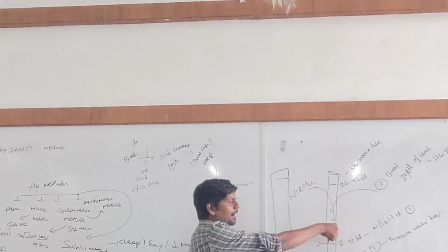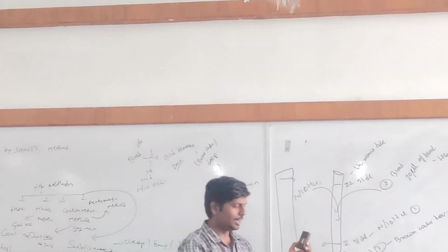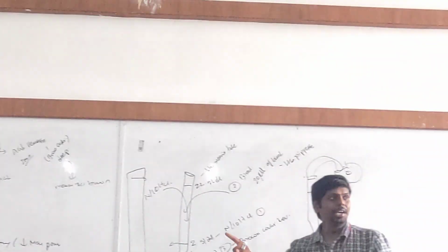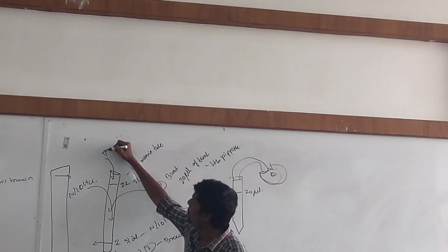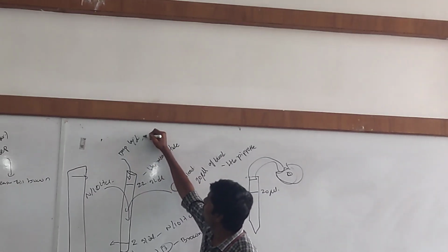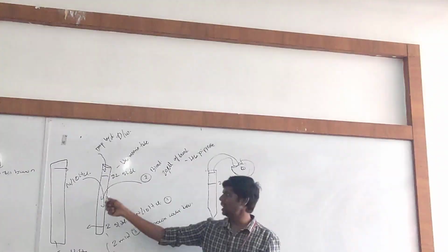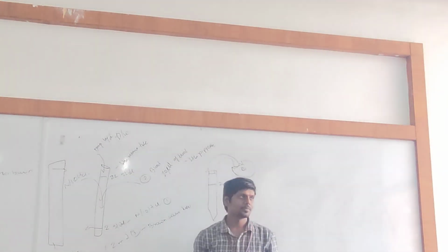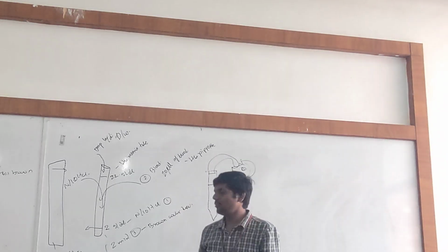We need to keep the test tube in this stand. Now we need to start adding distilled water to it, drop by drop. We are adding distilled water to this tube. Now, whenever we are adding distilled water, what happens?